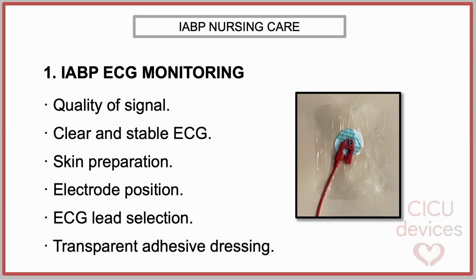The use of transparent adhesive dressings can help maintain electrode position, reduce movement-related artifacts, and protect against accidental dislodgement, especially in diaphoretic or restless patients. This strategy helps prevent partial detachment or micromovements of the electrodes, which often manifest as intermittent artifact, loss of signal, or misdetection of QRS complexes by the intra-aortic balloon pump. Transparent dressings have the advantage of allowing visual inspection of the underlying skin and electrode contact.